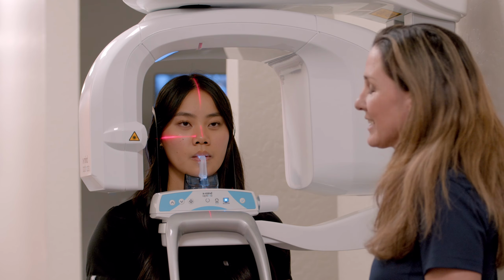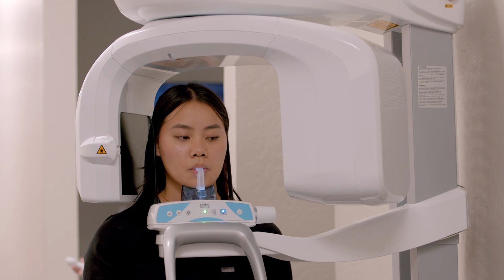And we'll come in here. Let's make sure the machine knows that we are ready. And we've got the green bar, so we'll go ahead and step over. Your exposure button's here. You want to make sure you're 6 feet away or behind a wall.